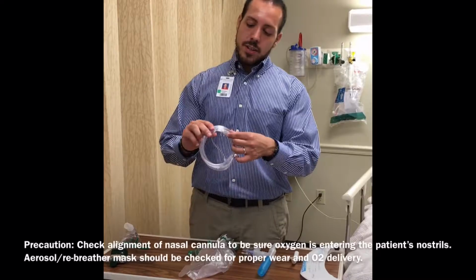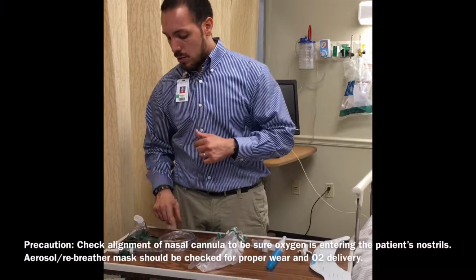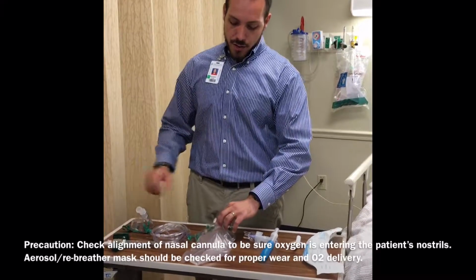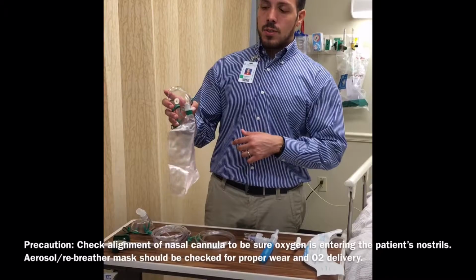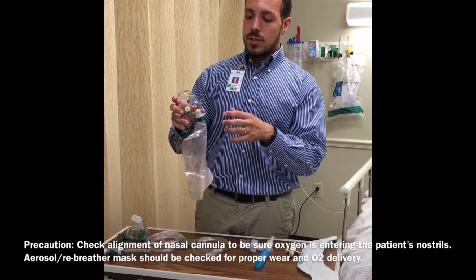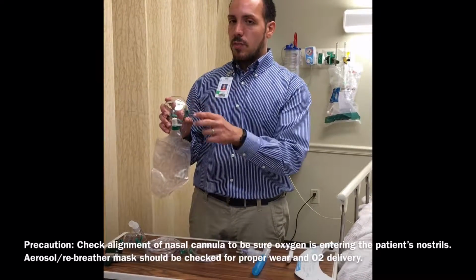And what we have right here is our nasal cannula, again wrapped around the patient's head and feeding into their nose. Then we have the actual face mask that they might be using in lieu of it. This device right here is called a partial rebreather. As you can see right here, there's a disc on it to prevent the patient from kind of breathing in their own oxygen or CO2. So this is partial because it has one side, and then a non-rebreather will have both sides.